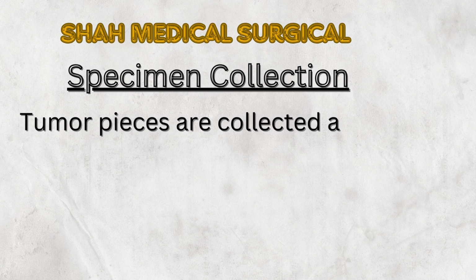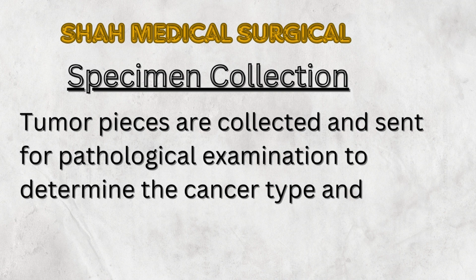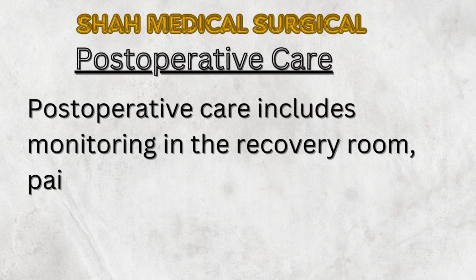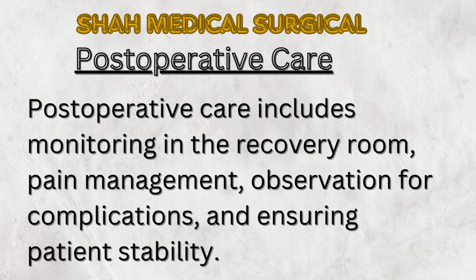Specimen collection. Tumor pieces are collected and sent for pathological examination to determine the cancer type and grade, critical for further treatment planning. Postoperative care includes monitoring in the recovery room, pain management, observation for complications, and ensuring patient stability.